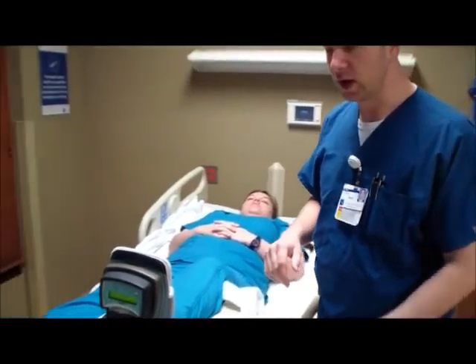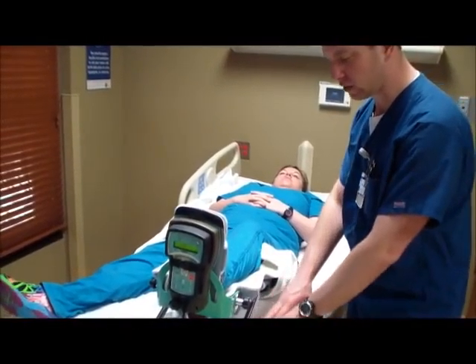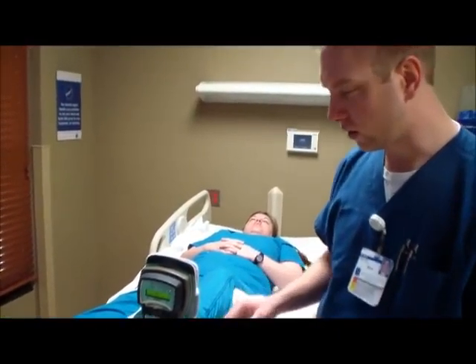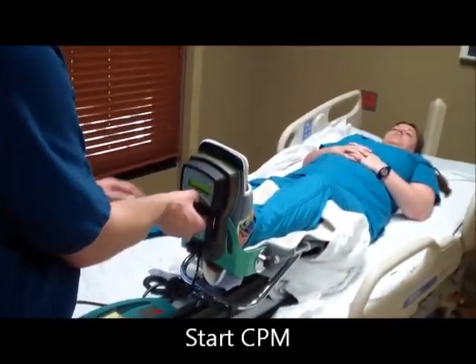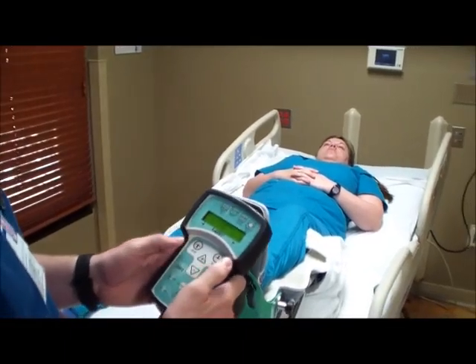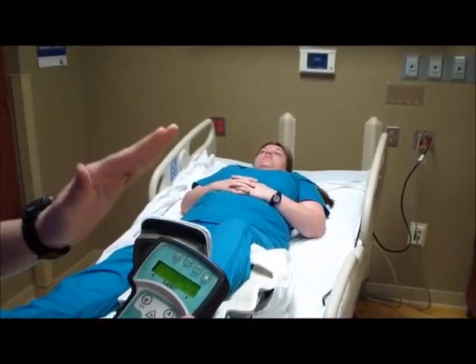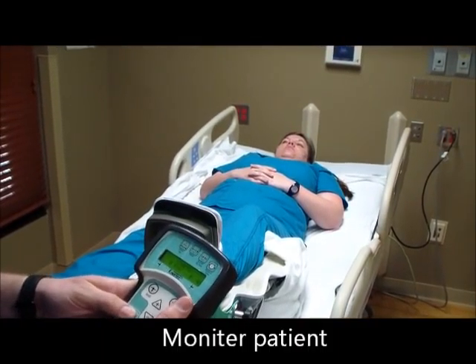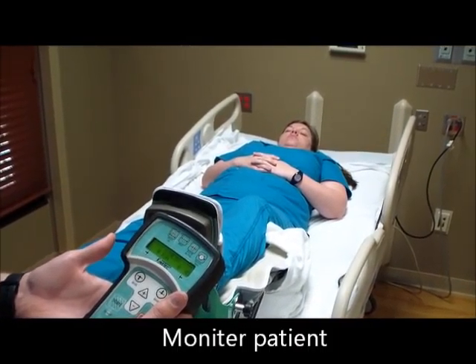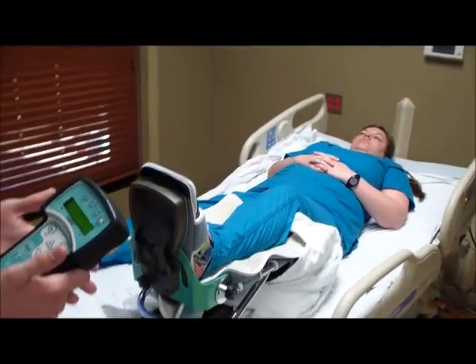So then what we're going to want to do, we have it secure at the end here. We have it in place. We have it in the right spot on our knee. We have it secured. So now we're going to want to start to run it. We're going to watch the patient's reaction as we turn the device on. So I'm going to hit start, and it's going to slowly start bending that knee.